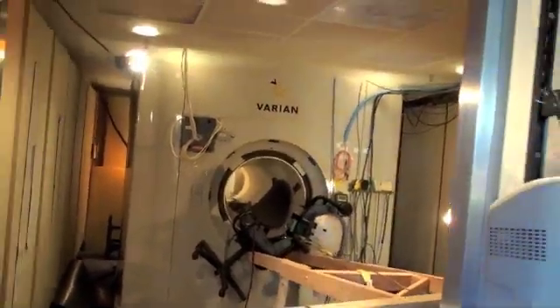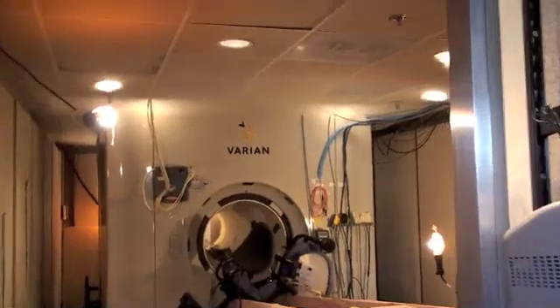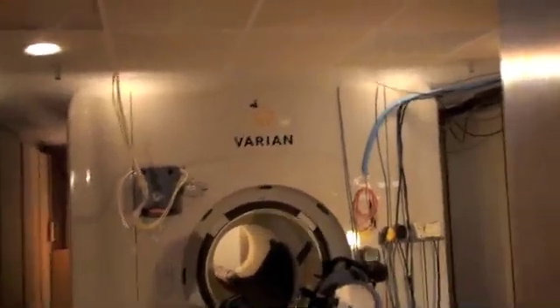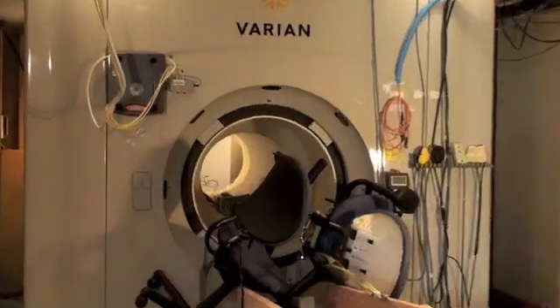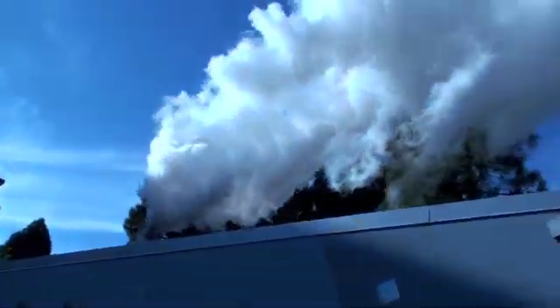Yep. What? Did everything go? Yeah, most everything's falling out. Oh, yeah. Fog building up. Look, fog on the ceiling. Go inhale. How fast did they fall? Yeah, it only took like 15 seconds. We'll see this.